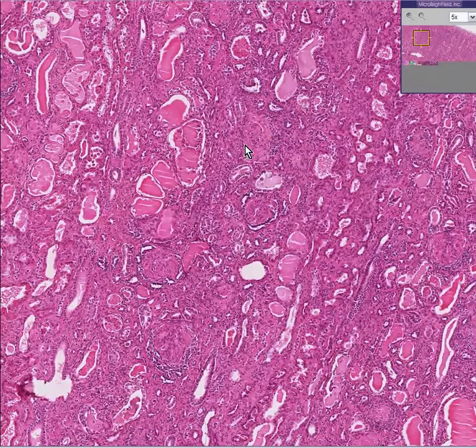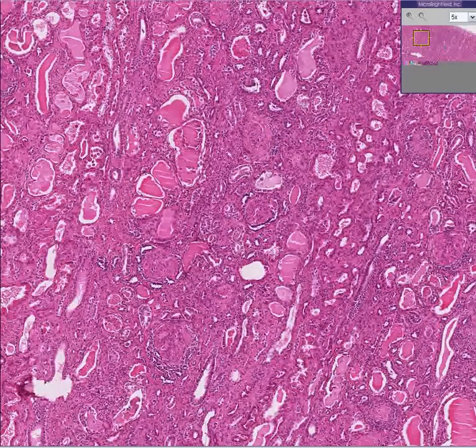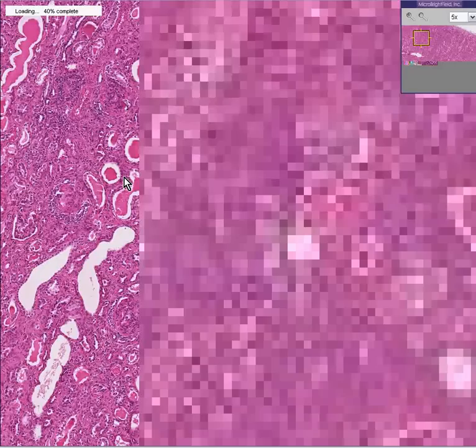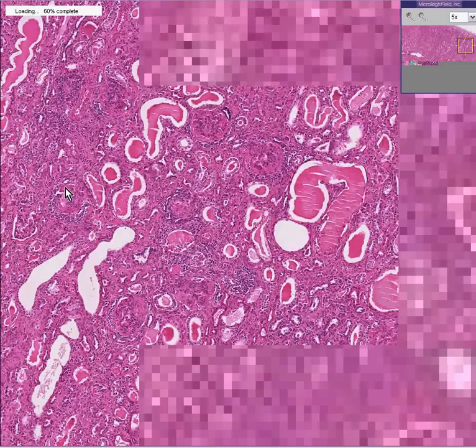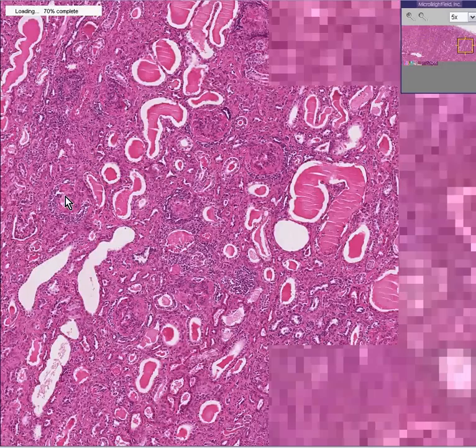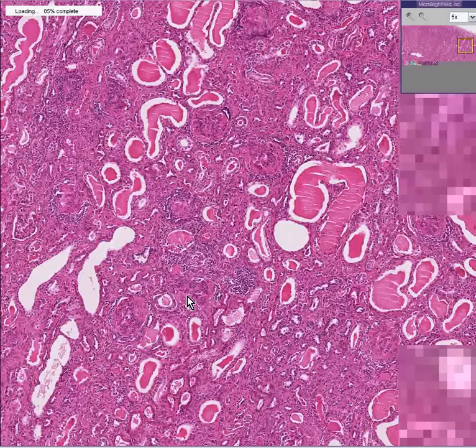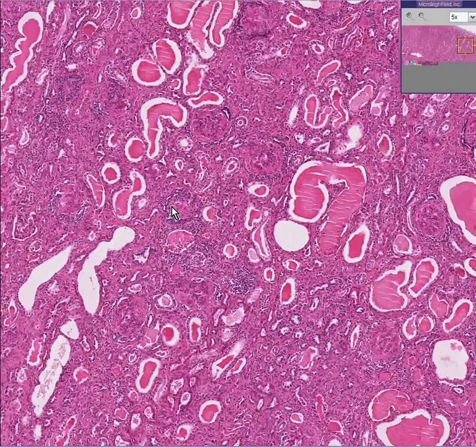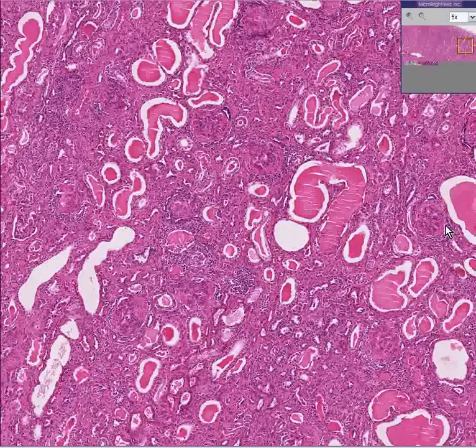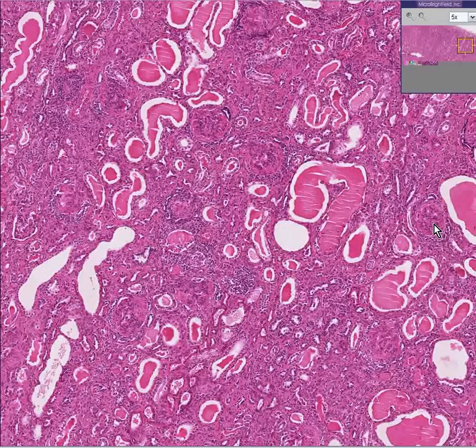Let's go to another random field. Bad glomerulus, bad glomerulus — essentially all bad. I don't really see any good ones — anything that looked like normal glomeruli where you could see podocytes, endothelial cells, and mesangial cells.